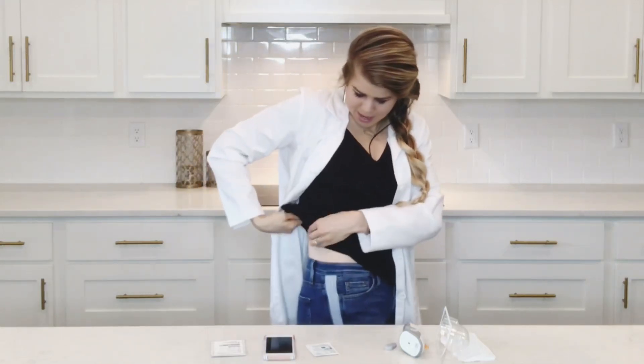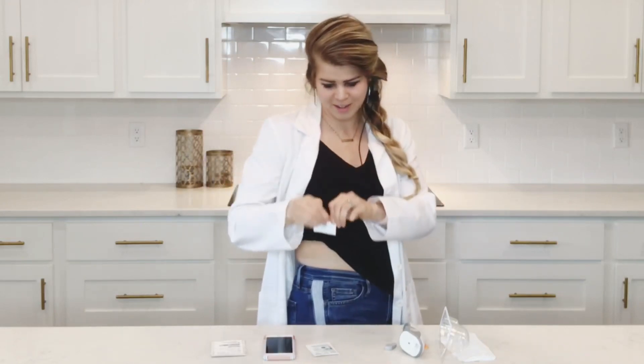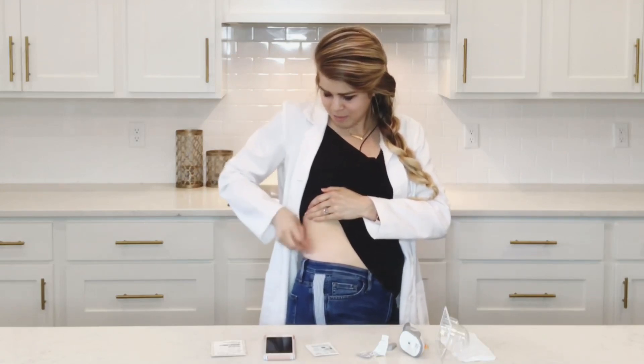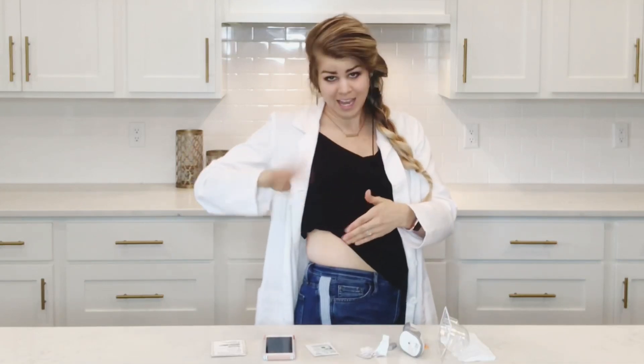Alcohol swab on my backside. If you want to try your backside and twisting around kind of freaks you out, you can use a mirror. I'm going to open this up and make sure that I am pretty liberal with it. Don't ever blow on it because then it gets germs in the area, but you can just wave at it. I'm impatient, so I like to wave.